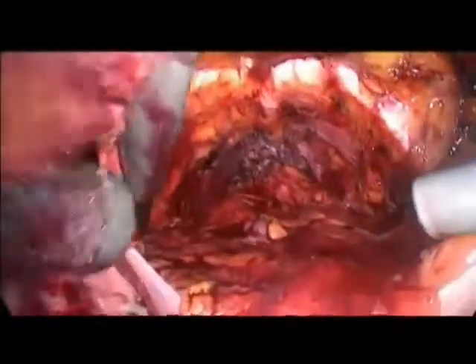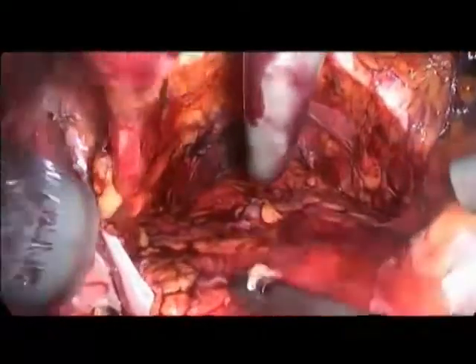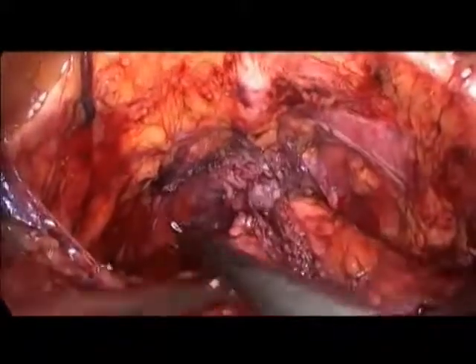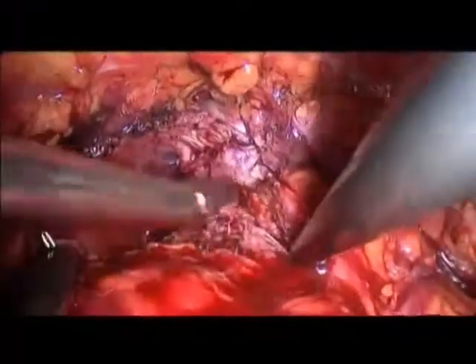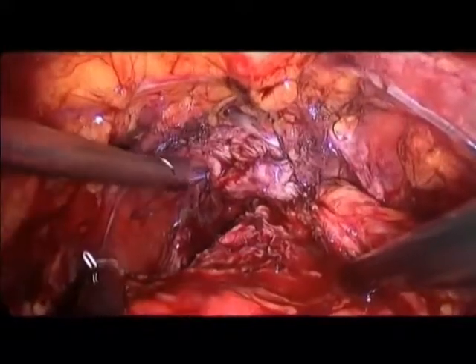really. Maybe we go just now to the other room until you have found what you want to do in this situation. And we look at what Günther is doing. You could see, and we will place the catheter under direct vision and then complete again the anterior aspect. So we can demount slowly.